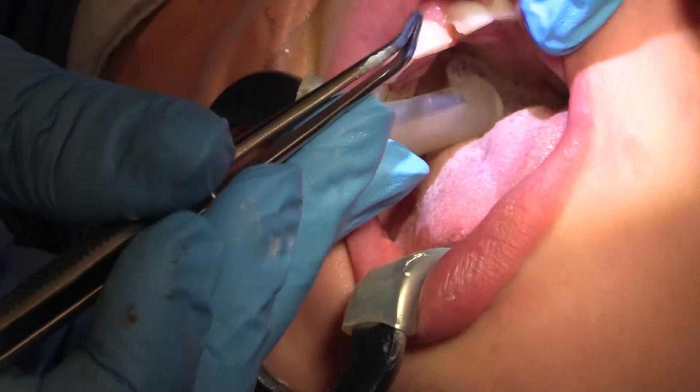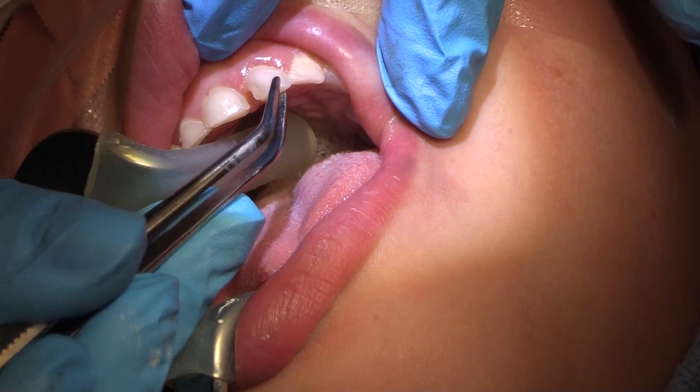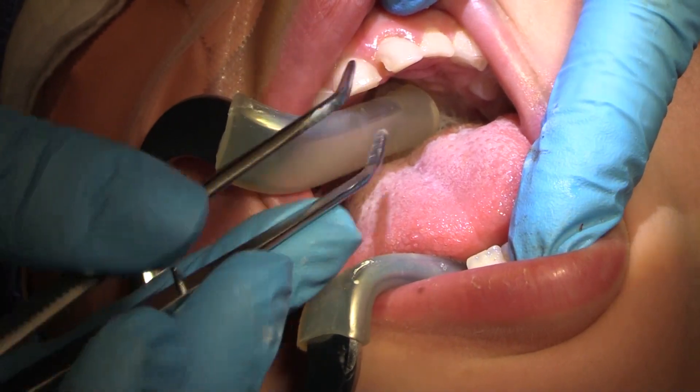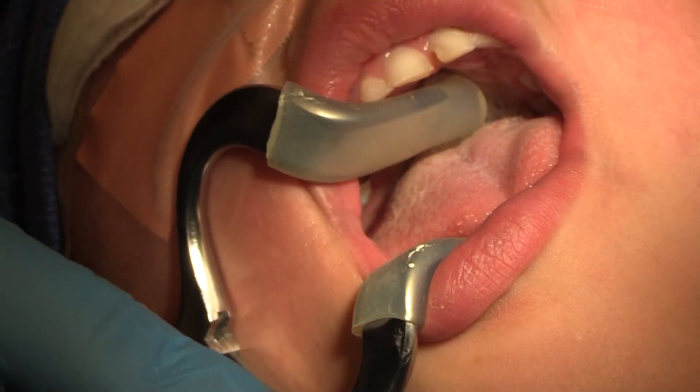So these anteriors we were talking about before — this kid is about six years old. They're getting a little bit mobile, not too much. He's got his lowers already, but they've got decay in them. They're no use keeping them around, so I'm going to extract those at the end of the case today.